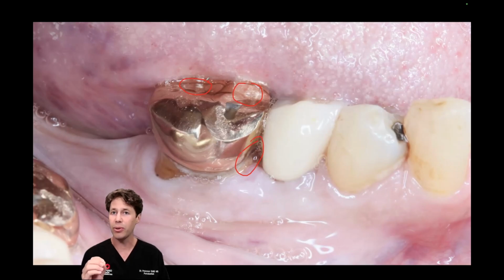So when I'm doing these immediate molar cases, here's going to be my incision design to give me best flap adaptation. I'm going to start intrasulcularly on one tooth in front of the area that we're working. So I tend to go to the midline of the line angle on tooth number 28, intrasulcularly around tooth number 29, intrasulcularly around tooth number 30, and I'm going to wrap around until I get to the mid-crestal ridge.